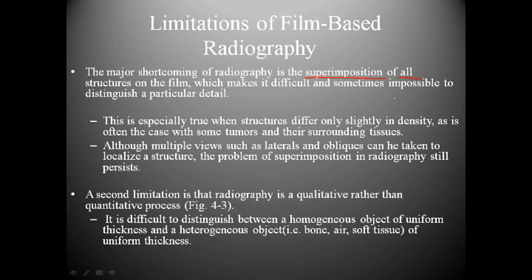For example, if you have a gunshot wound, you see an entry point, but you don't see an exit point. And so you shoot just a conventional radiograph. Basically, all you're going to see, if you only take one view, is just that this item is in there. You can't really tell where it is because of the superimposition.